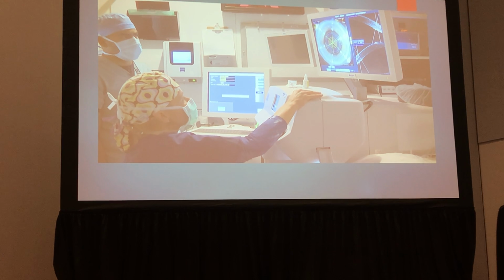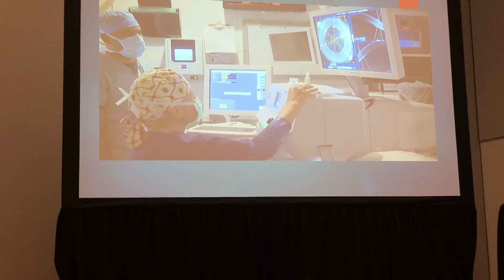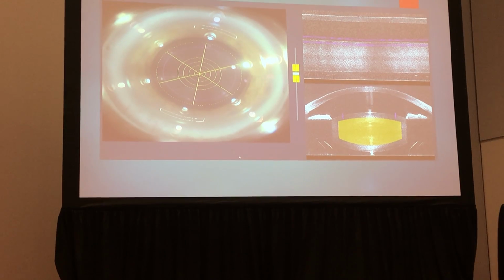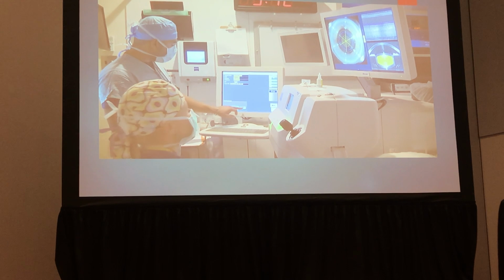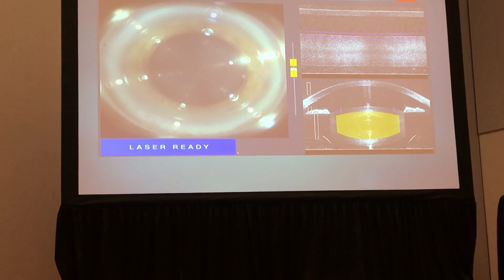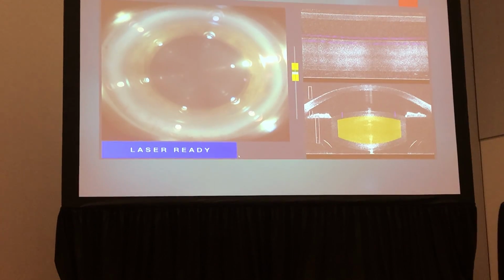Those look good. And we're going to verify and accept. I'm going to go to the top of the green so I have good pressure. We accepted all of that, so I'm happy with everything there. So we're going to go ahead and apply to the patient now. We're ready to treat. So we have 33 seconds of treatment. Be nice and still, don't move, don't talk.